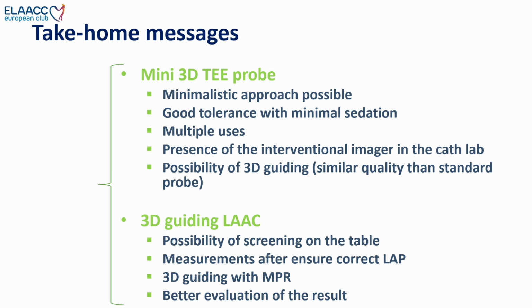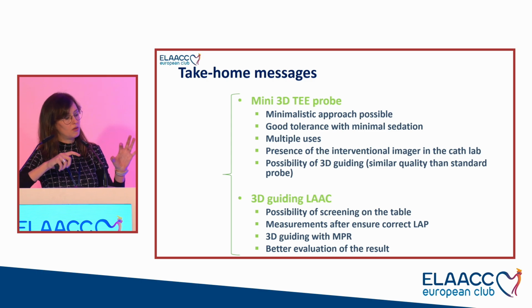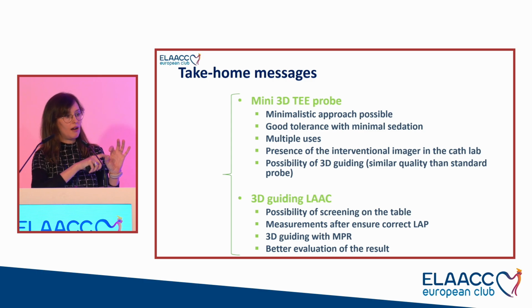And regarding 3D guiding, I think it's important that if you are very experienced, you can do the screening on the table, but only if you have different devices and so. You can also redo the measurements after ensuring that the pressure in the atrium is okay. And you can do this kind of 3D guiding that again, it's not so difficult to do. Now we are doing it in most of the patients. And you can also get a better evaluation because, I didn't put it, but sometimes when you have doubts, you can just spin around your lobe just to evaluate if you have any leak or not.